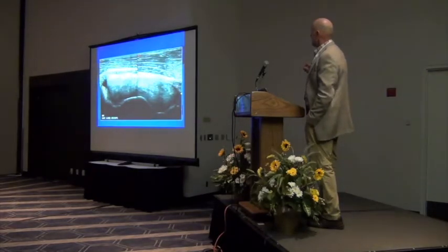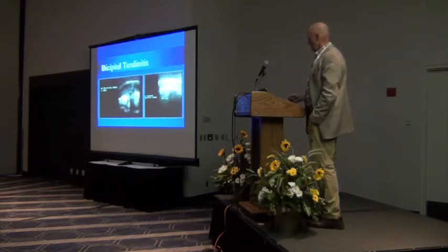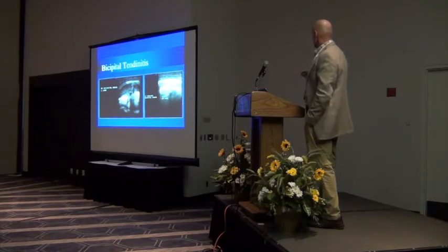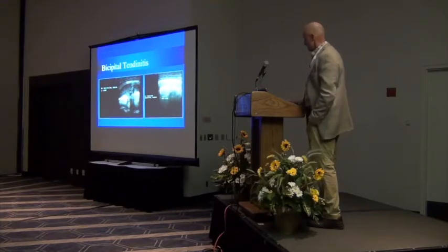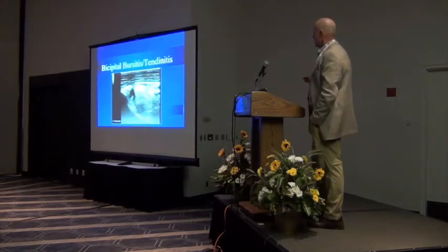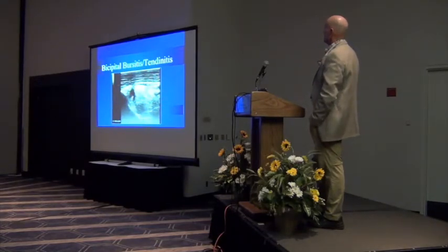And again, here's a case with the muscle bundle there and fluid starting to accumulate on that border. And then here's a more exaggerated case of a tendon injury. It's almost got a split in it with a lot of material in there, and just a very heterogeneous appearance. And most of the ones that we've seen have been lateral lobes, and as you can see here, there's very heterogeneous character here, as well as fluid.